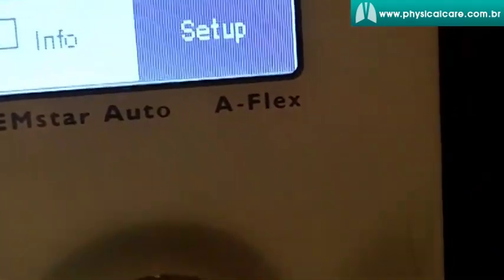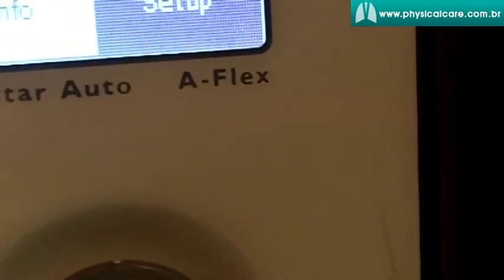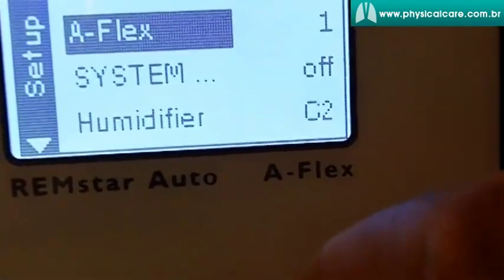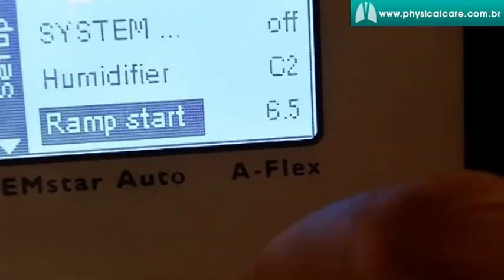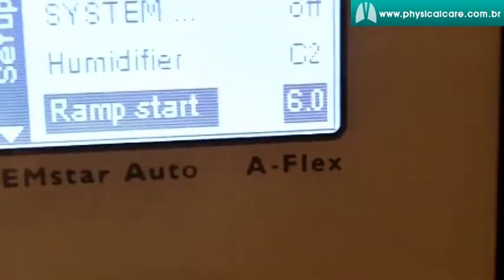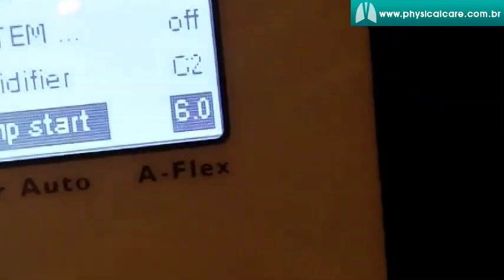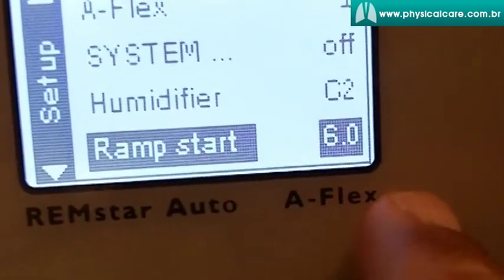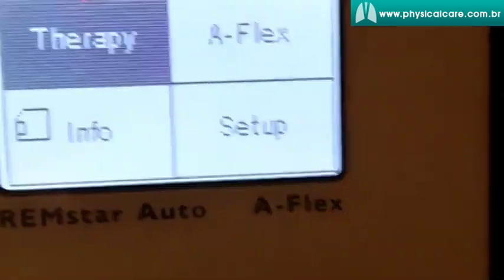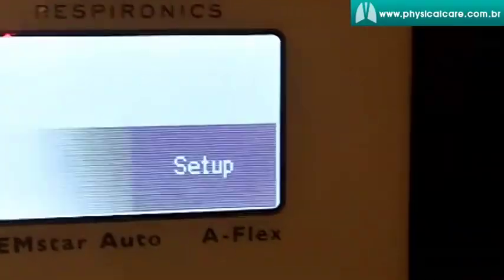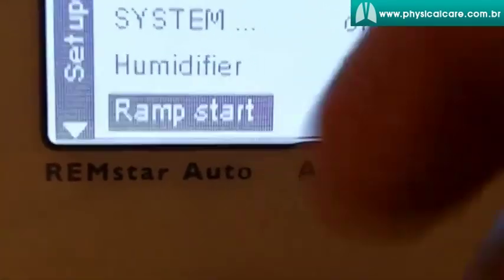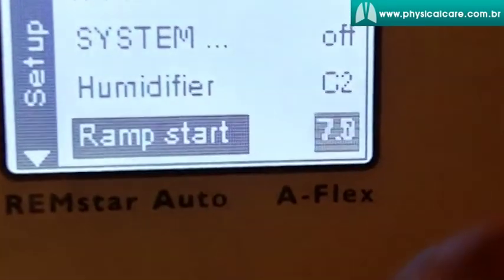This helps make it easier for you to get used to the machine, so you don't feel like there's a tornado blowing down your face. Here's the difference: you can control the ramp pressure here. I want to show you ramp start pressure. After a while, a large number of people, once they get used to the CPAP machine, may not like the ramp pressure — or you might find the ramp feature too weak, not enough air. In this ramp start setting, you can change it.